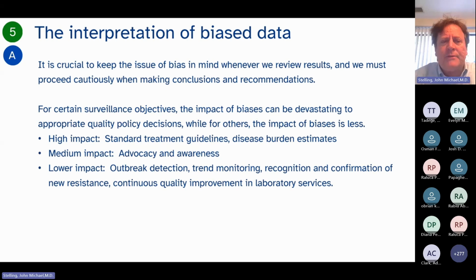Interpretation of biased data. It is crucial to keep in mind biases whenever we review results. We must proceed cautiously when we make conclusions and recommendations. Take a look at the time. For certain surveillance objectives, the bias is extremely important. For other uses of the data, the biases really are not so important.